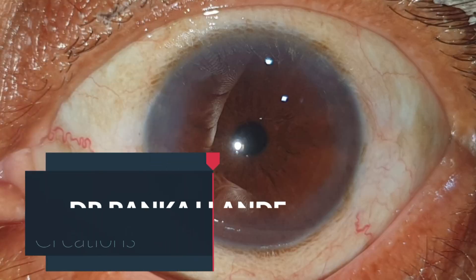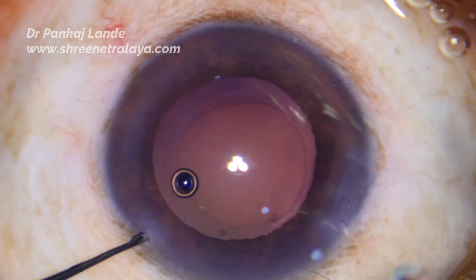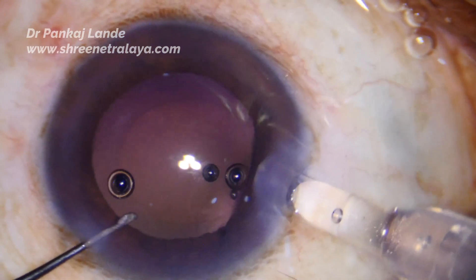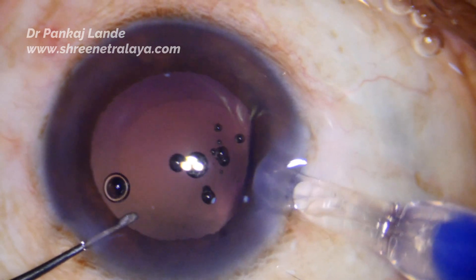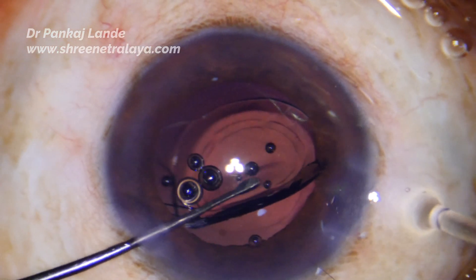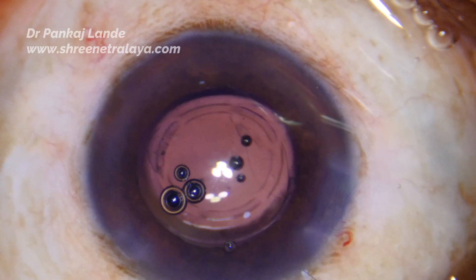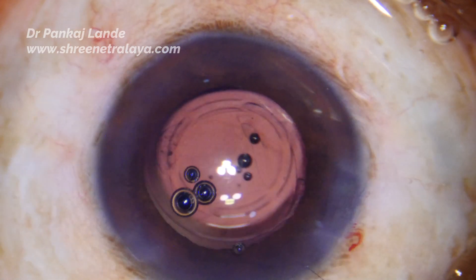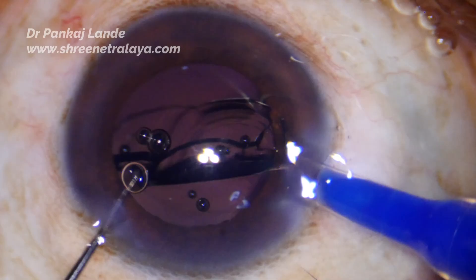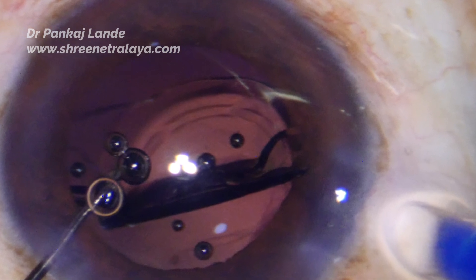Hello friends, welcome to Srinidra. After successful phacoemulsification, this situation can arise. I had a nice surgery and was implanting an IOL when I suddenly noticed that the trailing haptic of the IOL is broken. The trailing haptic got stuck into the cartridge and cut at the optic-haptic junction, so there is no way I can manage this IOL in the bag with good centration. IOL exchange is the only option.